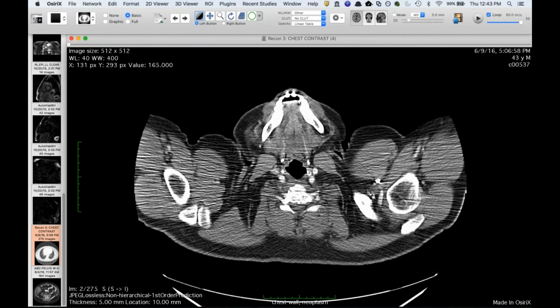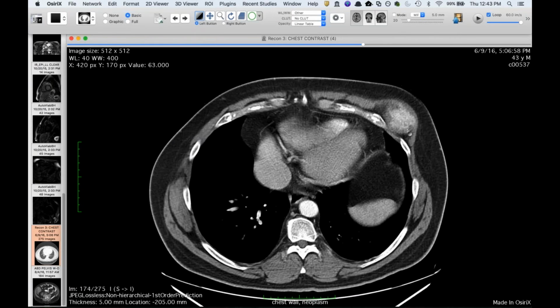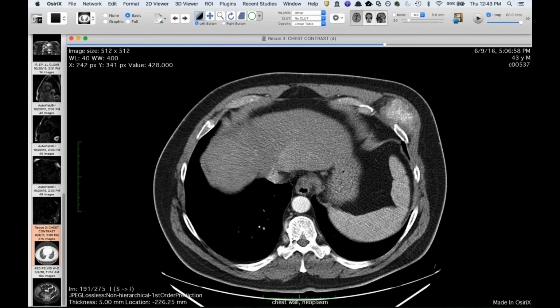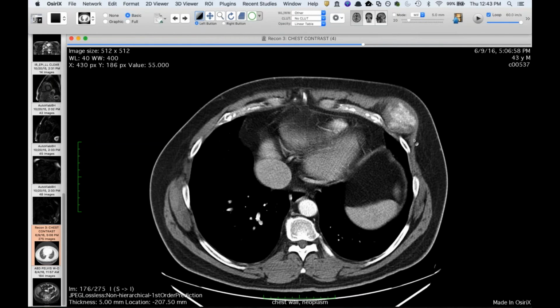The patient had a CT of his chest, and you can see a similar enhancement pattern. It looked like it was superficial to the ribs and deep to the pectoralis muscle. The good news is it hadn't changed. And this was an outside study that they brought to us for consultation. I guess this is painless. We didn't know what it was.